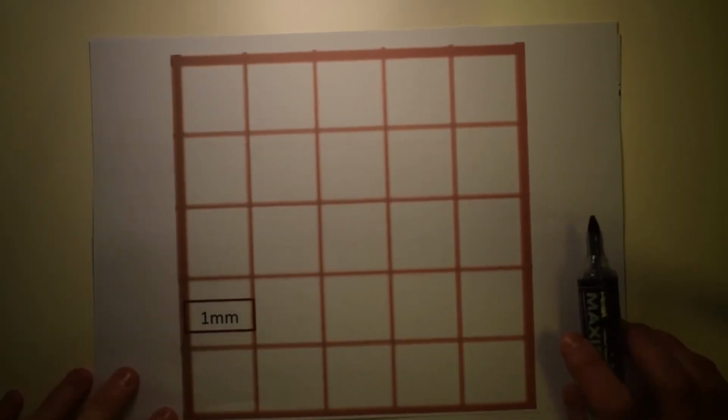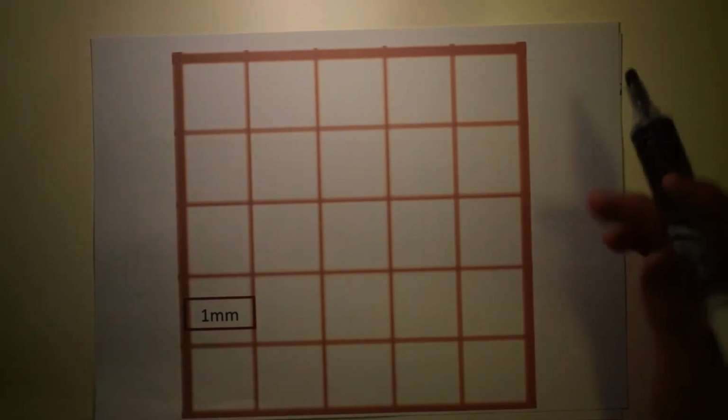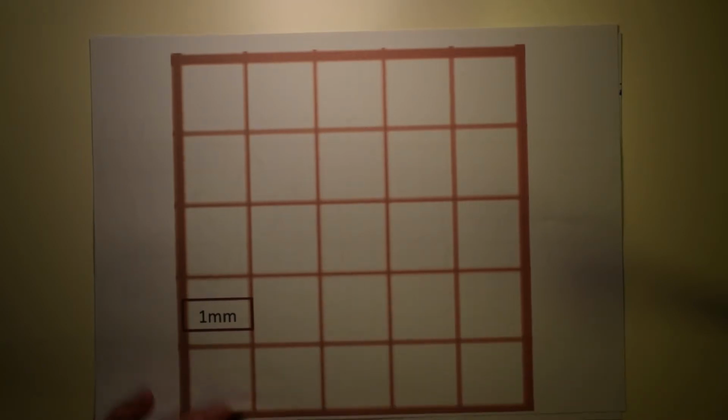Alright, let's talk about ECG paper. Each square has a square inside it, and this is how we measure how long, say, the P wave is going for, or the duration of the QRS, or the height of the T wave. Each tiny little square is 1 millimeter, and each millimeter is equal to 0.04 seconds.